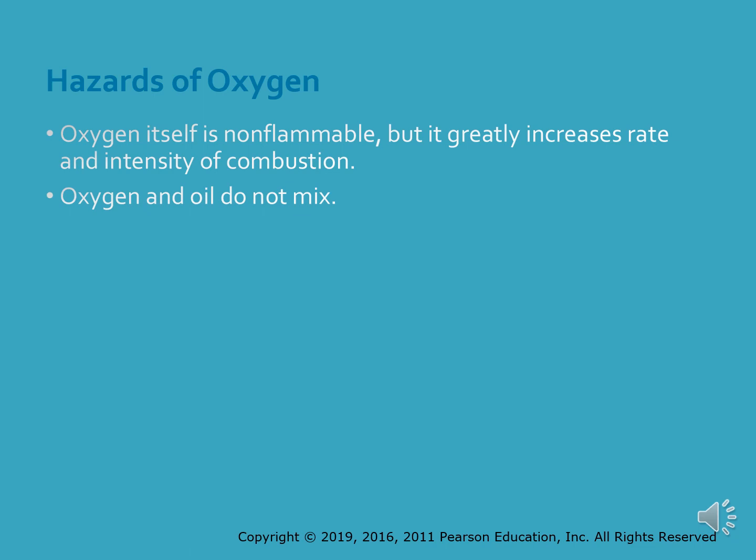Oxygen supports combustion and causes fire to burn more rapidly. Oxygen and oil do not mix. When they come into contact with one another, there can be a severe reaction which may in turn cause an explosion.